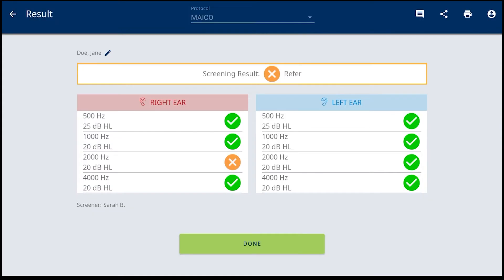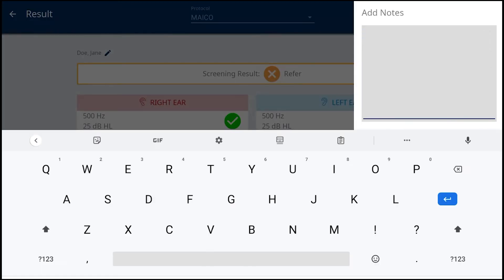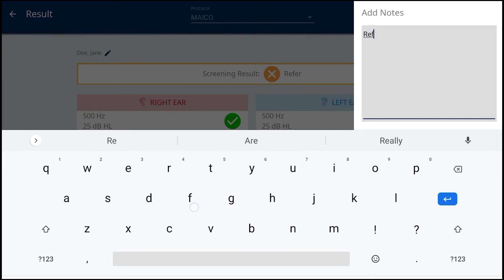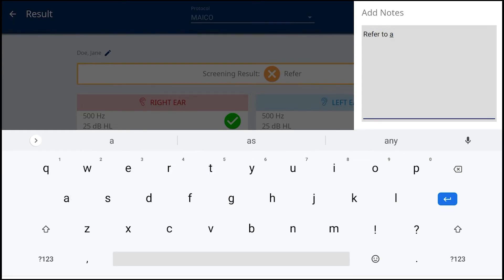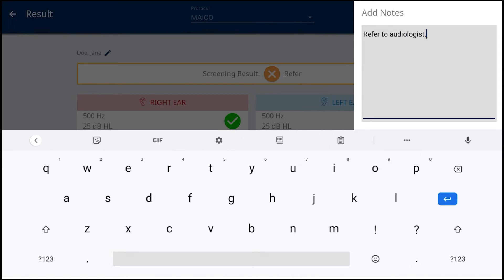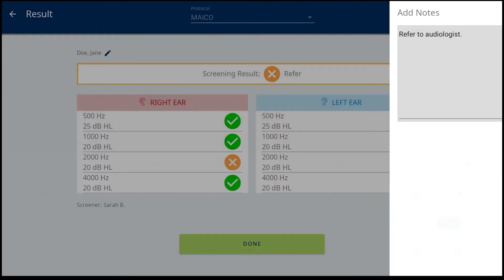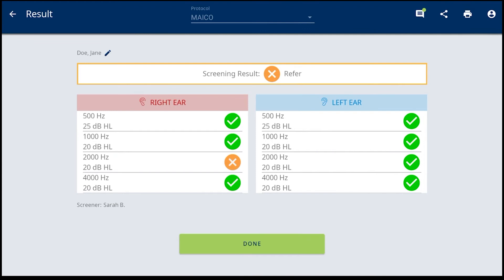Notes icon opens a slide out comment box to enter additional information. The notes entered will be included on the printouts. Once a note is entered, tap outside the slide out to close the note, and the icon displays a green dot.